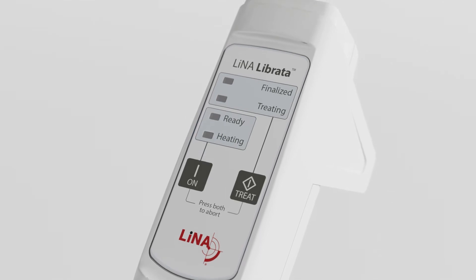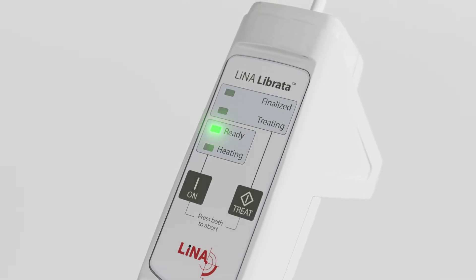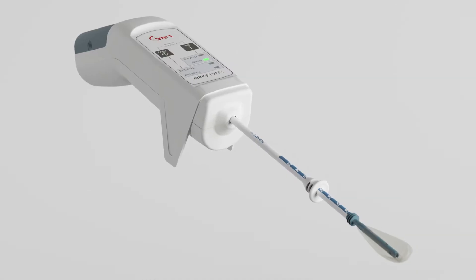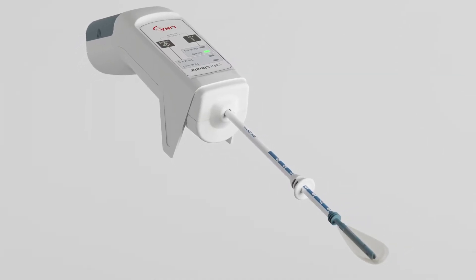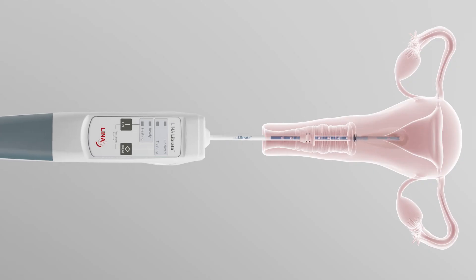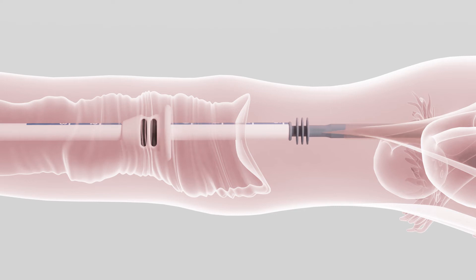After preheating is complete, the ready light will illuminate and you have 30 minutes to start the procedure. The slim 5.4 mm catheter requires minimal or no dilation. Insert the catheter into the uterus until the indicator ring reaches the cervix.